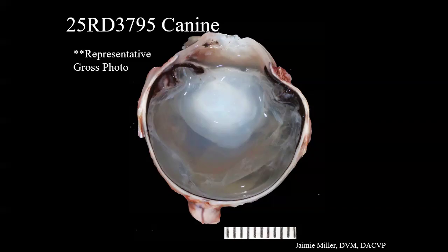We ended up getting both eyes from this dog. This is, again, a representative photo because we did not have a gross photo of either of the eyeballs that were removed, but I thought this was maybe representative. The history we got in this beagle mix is the left eye is diagnosed with end-stage glaucoma. They said the globe was buphthalmic and non-visual, and that there was hyphema of undetermined etiology. The right eye, they said it was more acute glaucoma, and it had anterior lens luxation and a hypermature cataract.